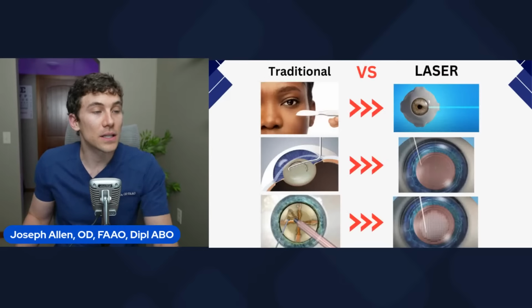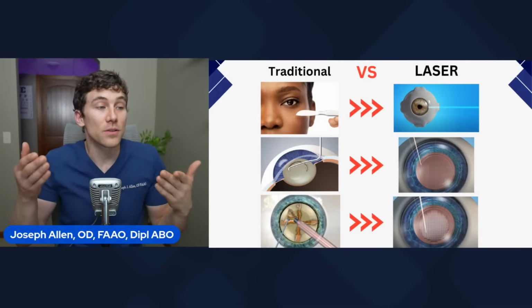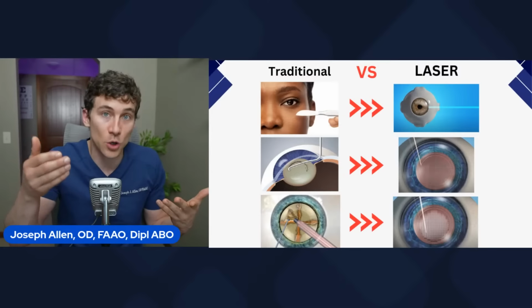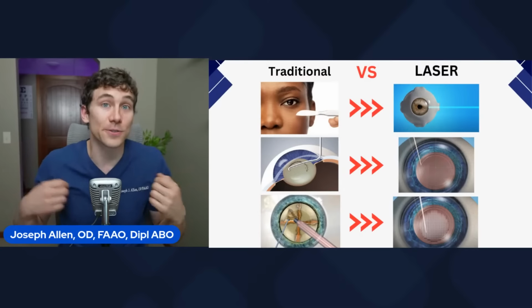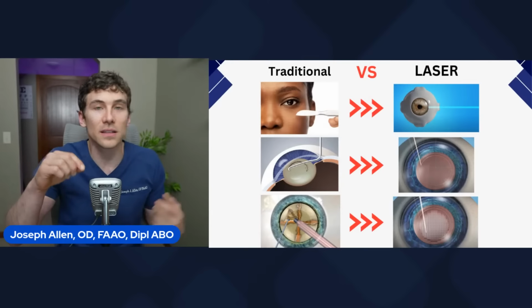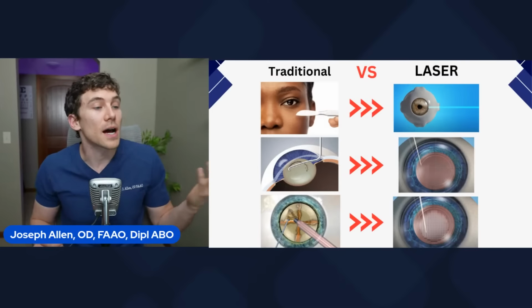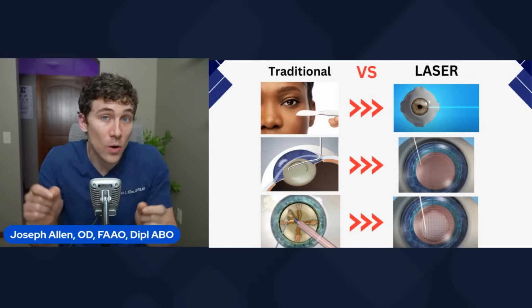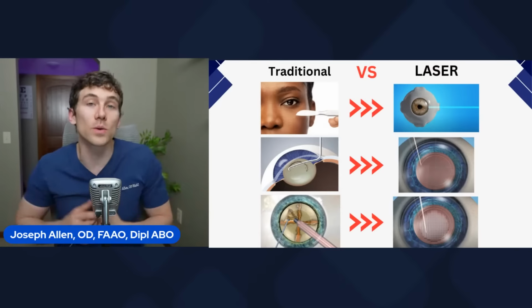And really the difference is that in traditional methods, like we saw in that animation, we traditionally use a type of scalpel blade to create an open wound on the eye. In laser cataract surgery, they use a laser to make that incision. Very precise, and it causes typically less inflammation, that is believed. The other component is that capsulorhexis, where they create a hole in that bag. That, instead of being done manually, also is done with a laser.